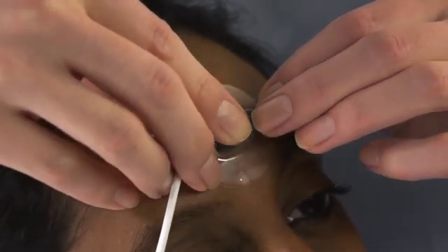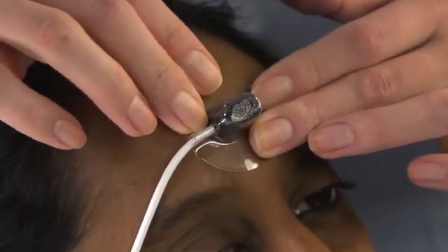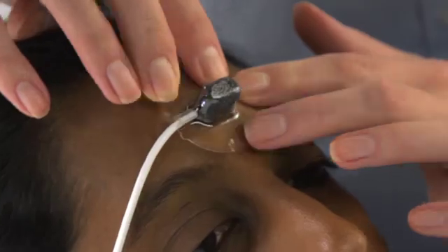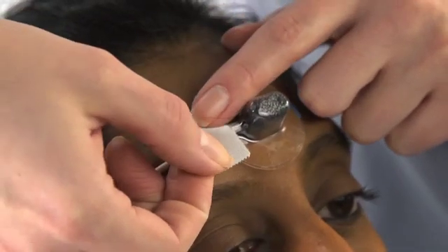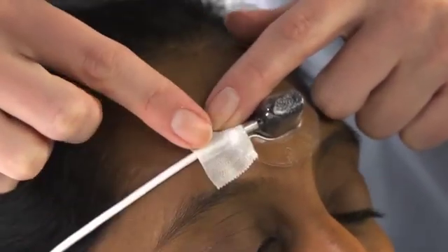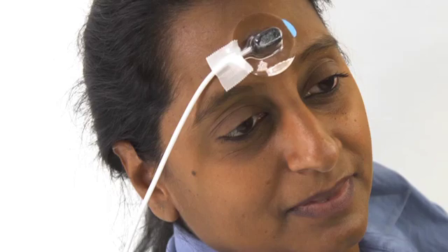Now, gently press the sensor and holder to the selected forehead site. The adhesive will gently secure the sensor against the skin. Apply a piece of dressing tape over the holder to keep it firmly in place. The cable can be routed to one side of the patient to allow movement for cardiac stress testing or general movement.